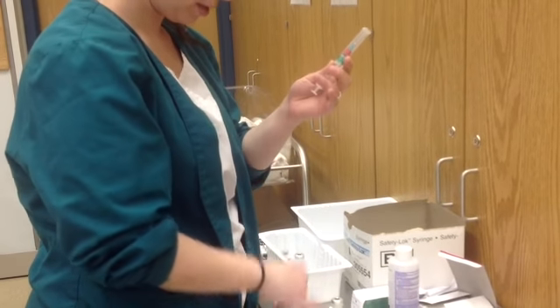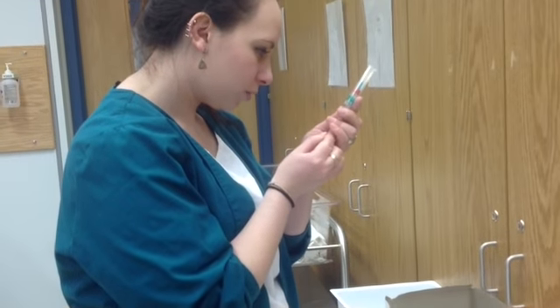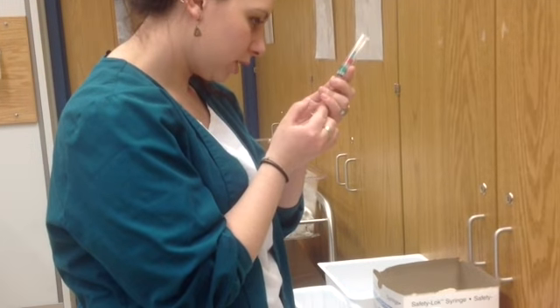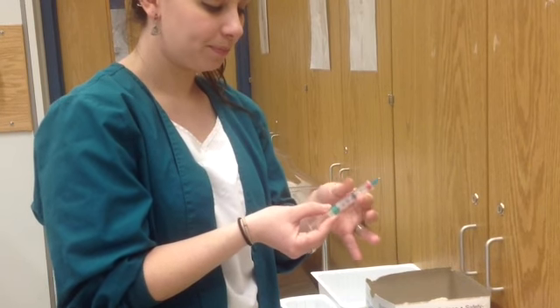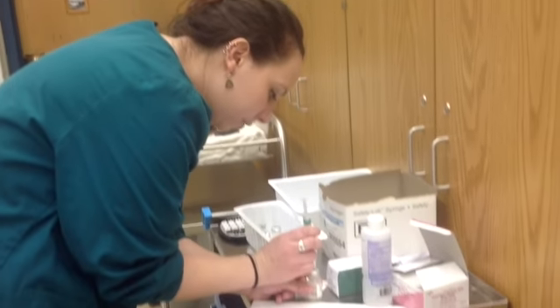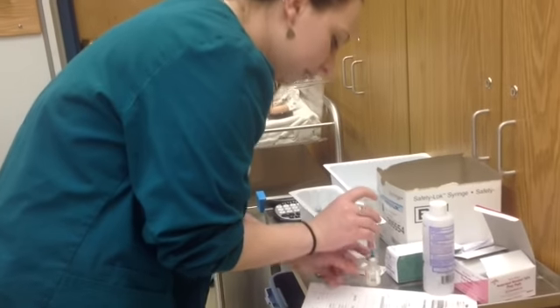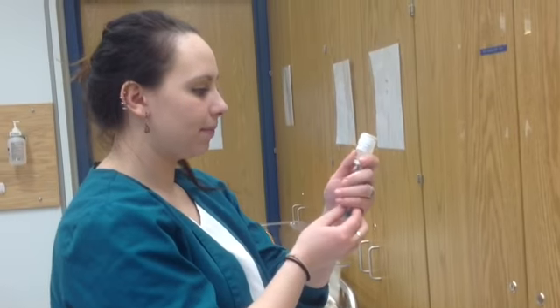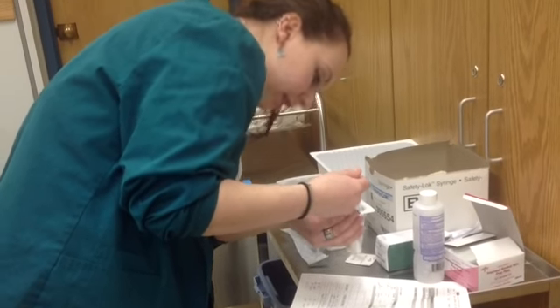So I'm going to pull the plunger back to the 1.2 mLs. That matches with my MAR. 1 down, 1.2. Okay, so I'm going to pull the shield back. I'm going to inject air into the vial first. I'm then going to rotate. And now you're going to pull back on the plunger. Now, you should hold the plunger in, because the air will push back on the plunger and pull it up, which is what just happened to me.